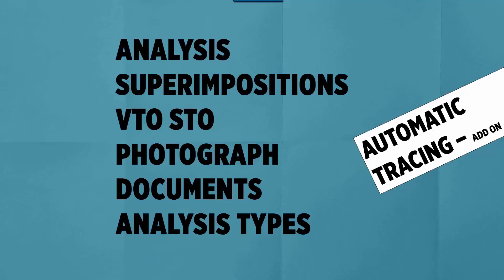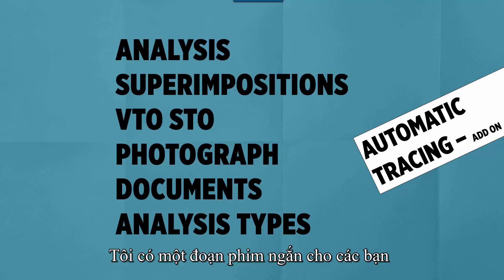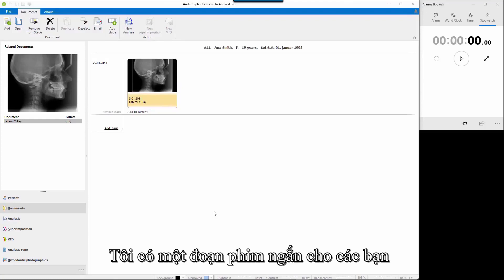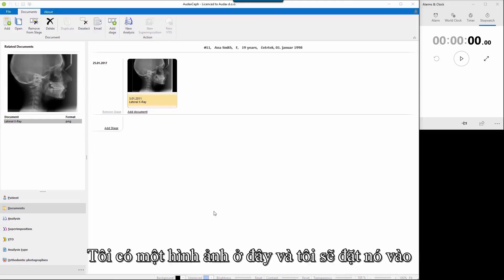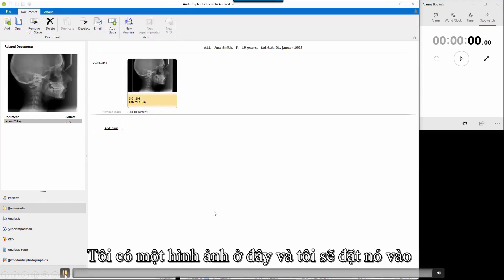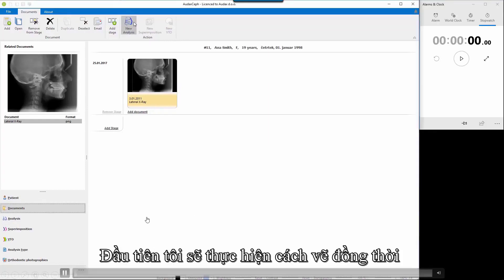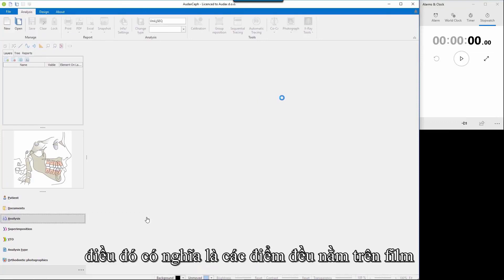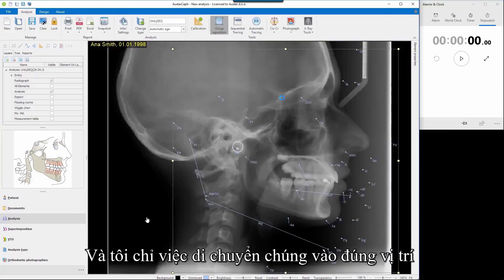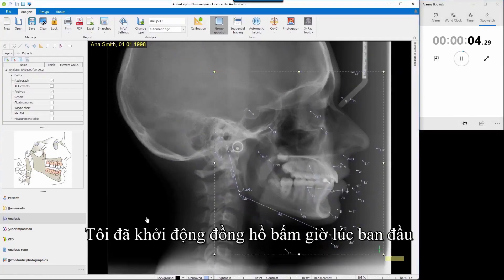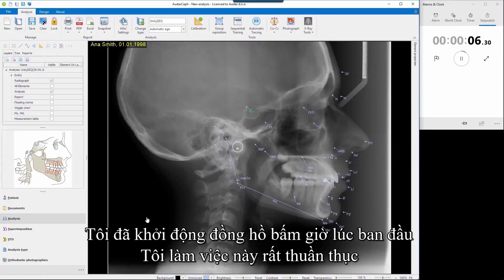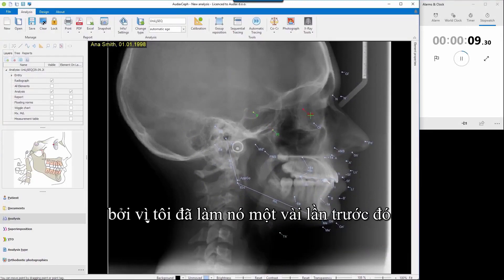There are three tracing methods: tracing concurrently, tracing sequentially, and tracing automatically. We'll measure the results for each. I have an image here which I'll put into the canvas, and first I'm going to do tracing concurrently — that means all points are already on the canvas and I'm just going to move them to the right position.